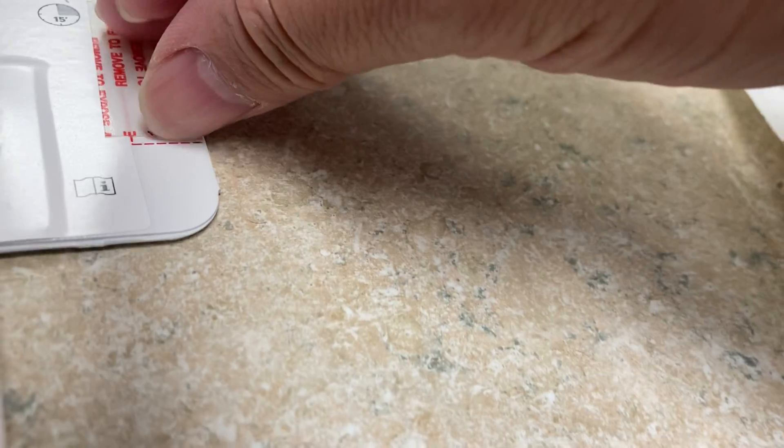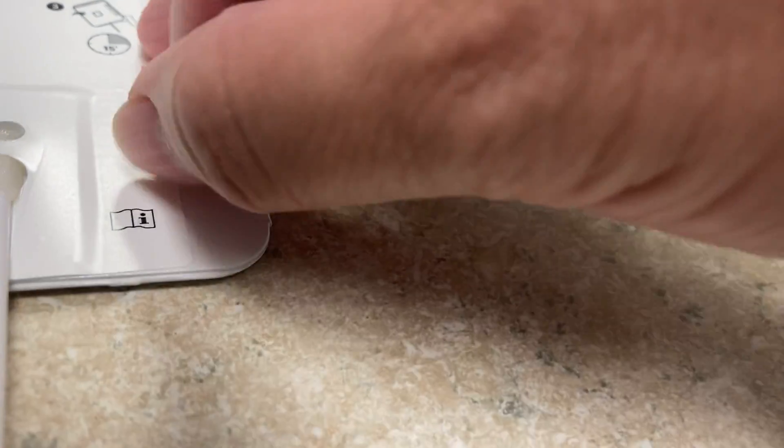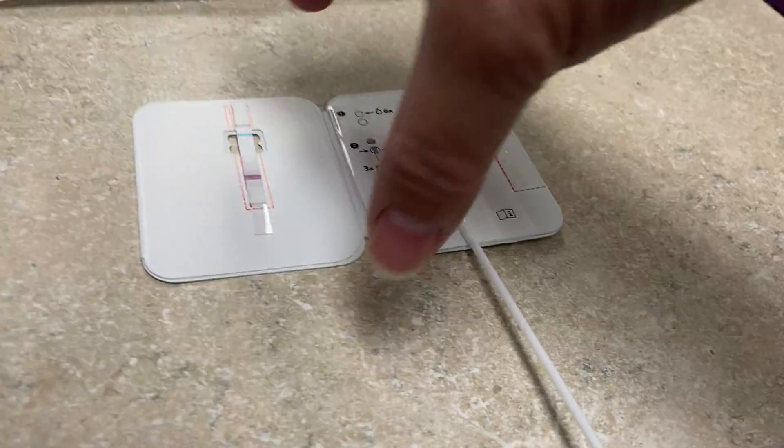Leave the swab in there, then remove the sticker and close the hatch.